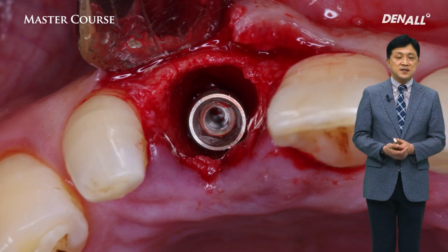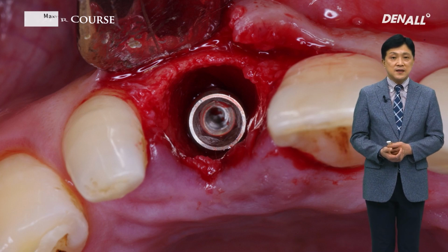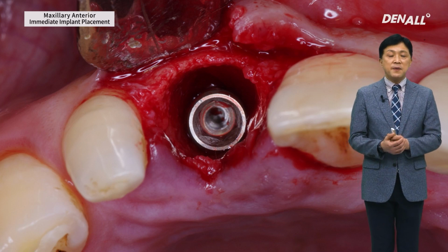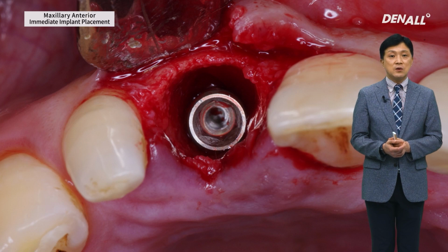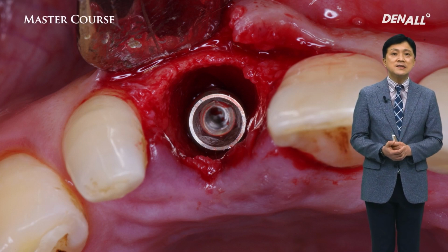An implant is placed. The buccal gap is what you're seeing right now. In this case, it is not in complete contact with the palatal wall, so this happens a lot. So this is a little bit labially pushed.